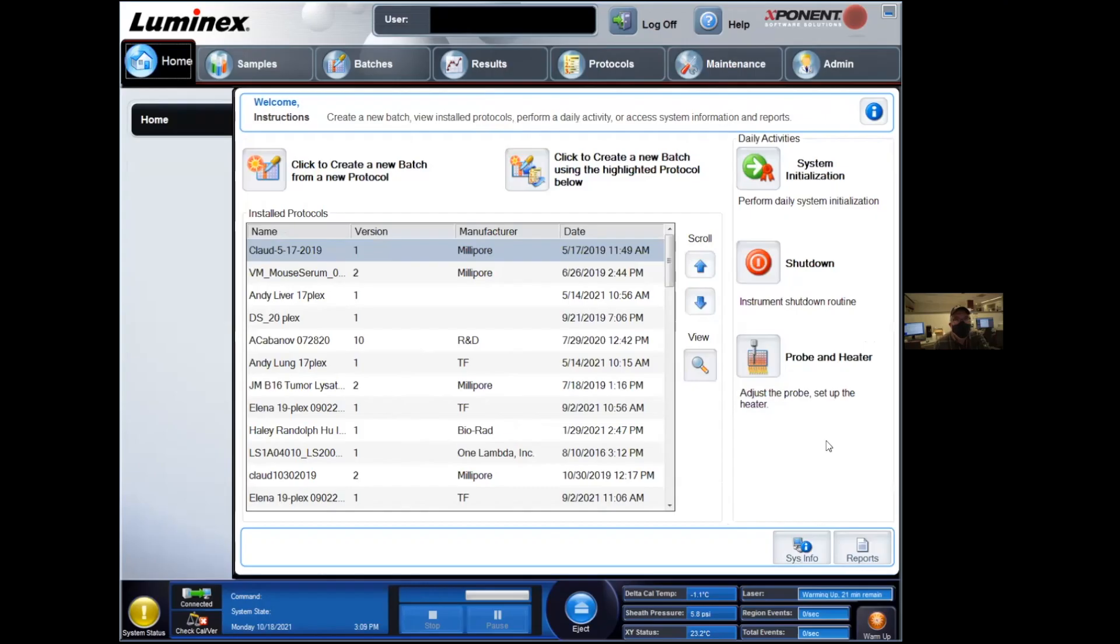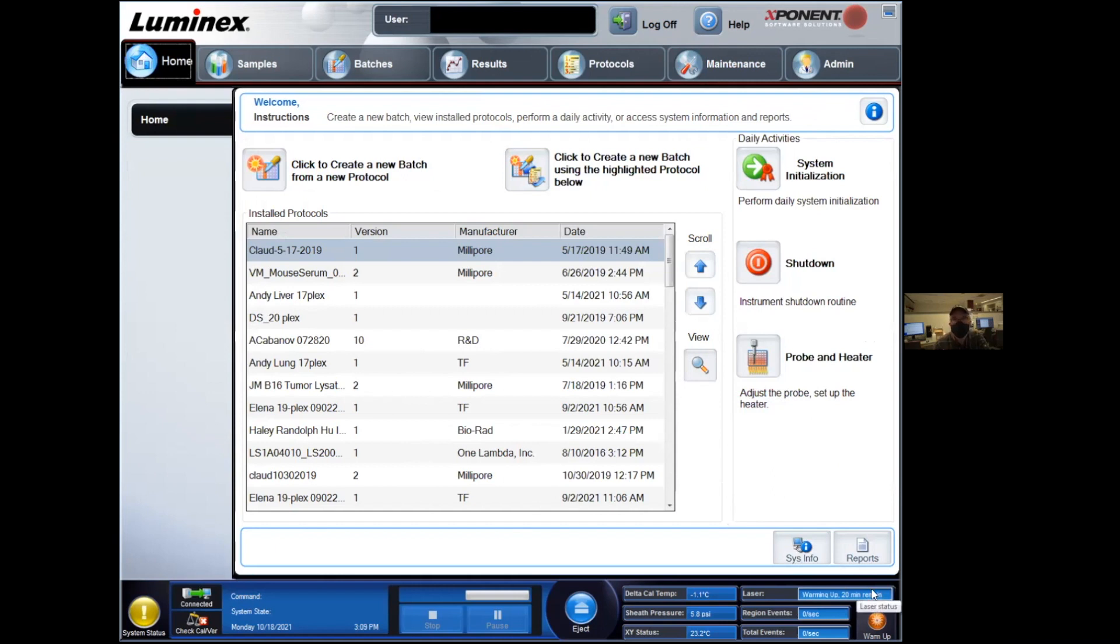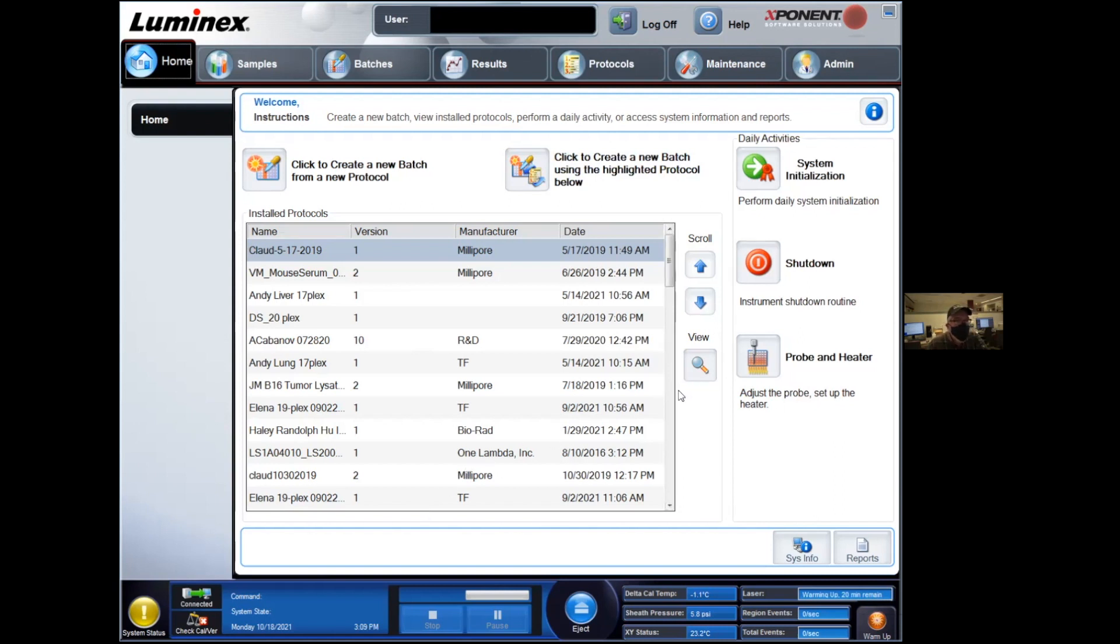When you open the instrument, you'll see first that we have a warming period that we need to complete before we're allowed to move on with the rest of the setup. This takes about 30 minutes, which is why whenever you want to use this instrument, we recommend calling the lab ahead of time so that we can do all this stuff for you, instead of you having to come here and waste a bit of your time to do something that is fairly trivial.